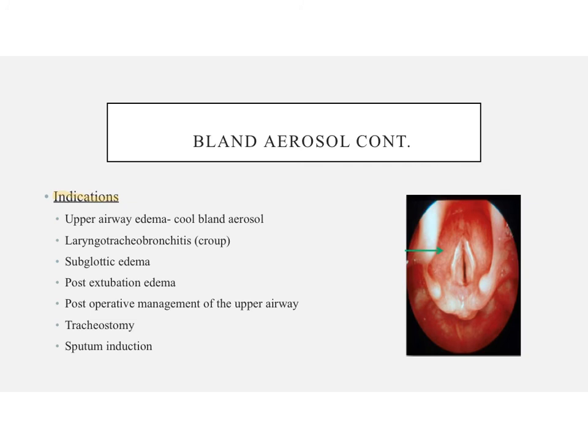We also use bland aerosol therapy for post-operative management of an upper airway, a tracheostomy for patients who are not being mechanically ventilated, and for sputum induction. So a sputum induction is a process where hypertonic saline is nebulized in attempts to acquire a sputum sample.